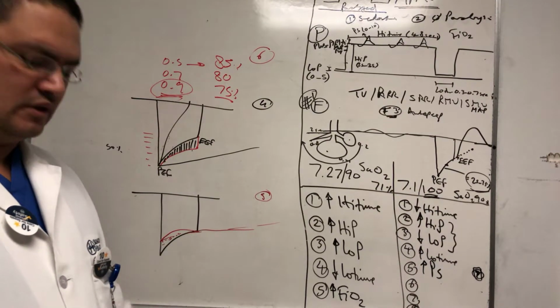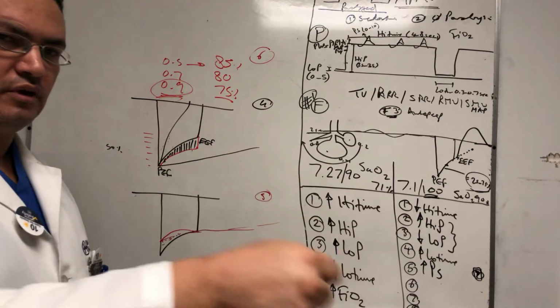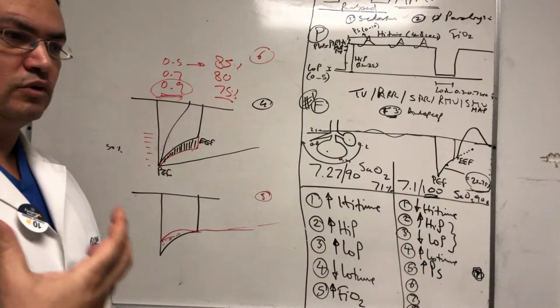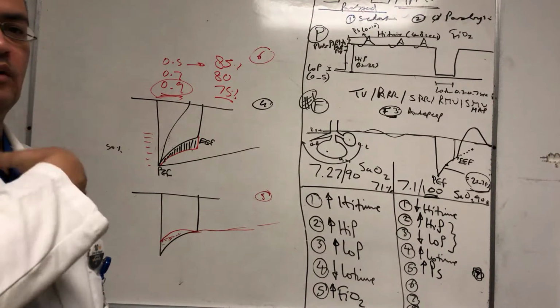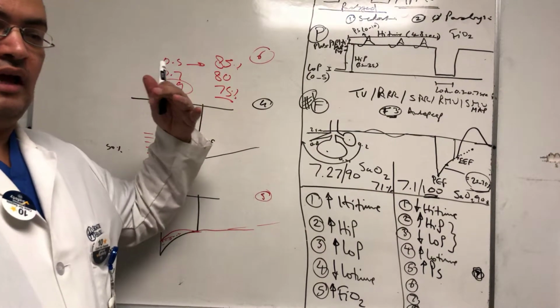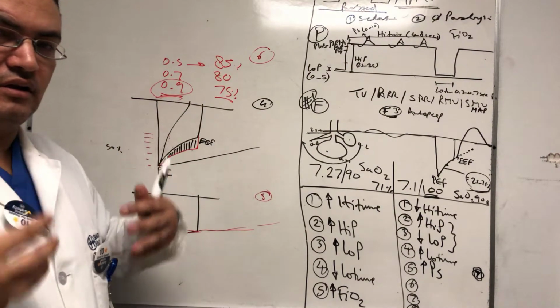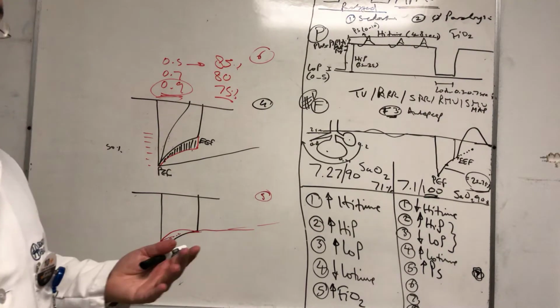So when you give somebody positive pressure ventilation, like volume control, you're pushing air in, the air will go into the path of least resistance, so we'll open up the West zone number 1 of the lung first. We'll just open up this and distend it even more, and then start to fill less and less, and the least filling happens in zone number 3. That's because it's positive pressure ventilation.